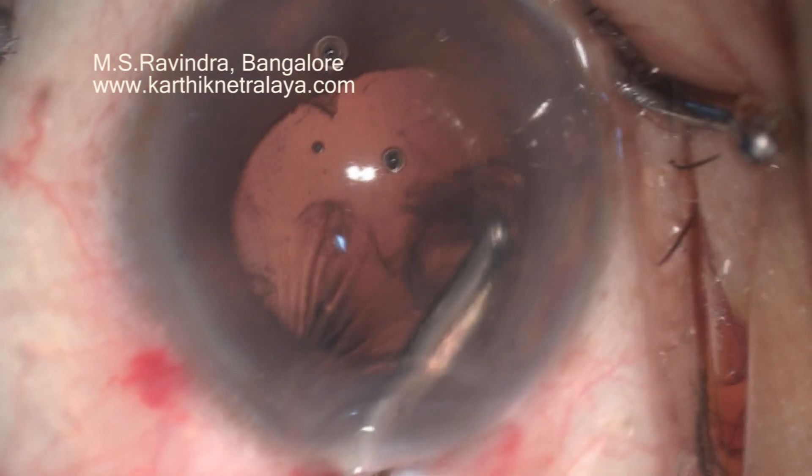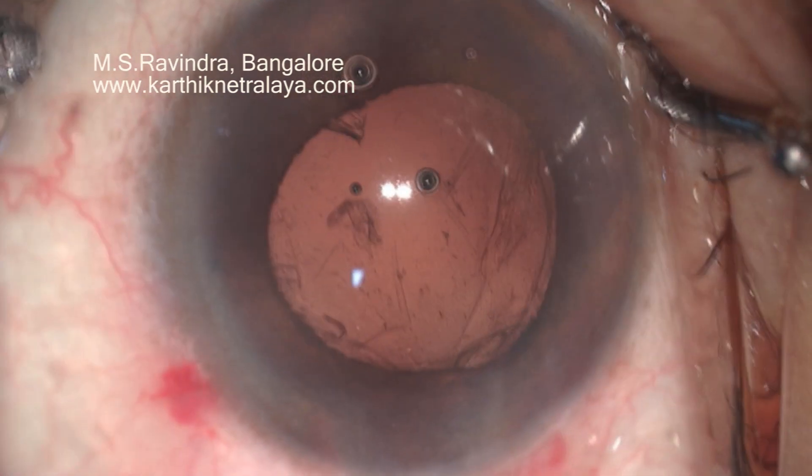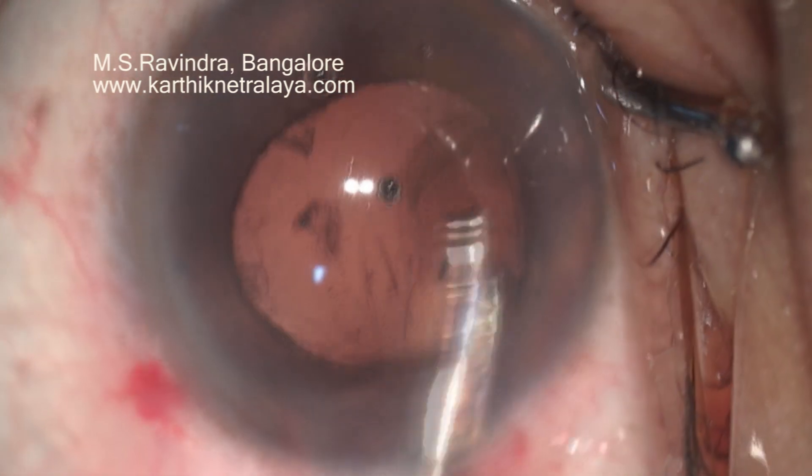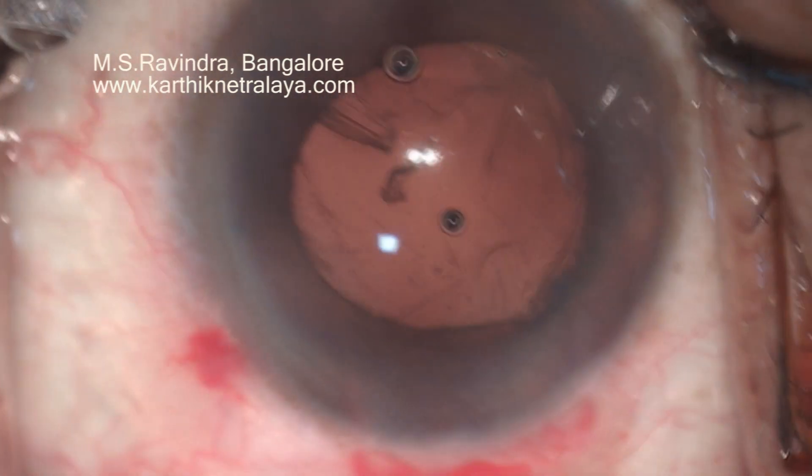A large posterior capsule rent was observed after the extraction of the nucleus and much of the cortex. Very carefully, the remnant cortical fibers were aspirated.